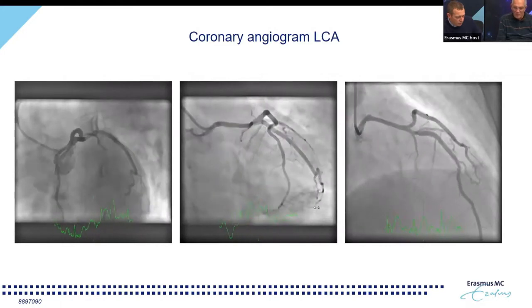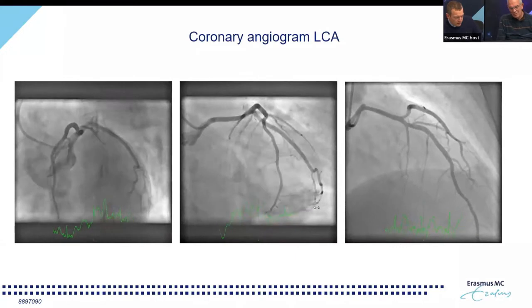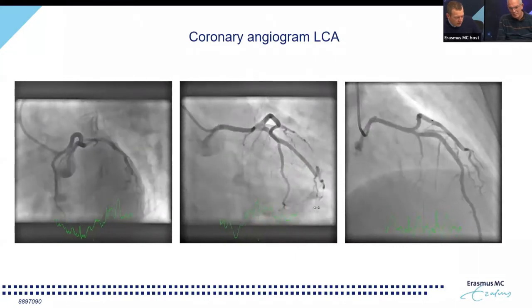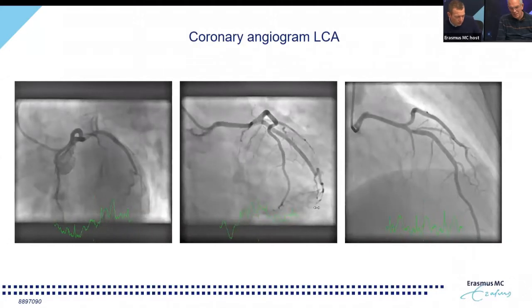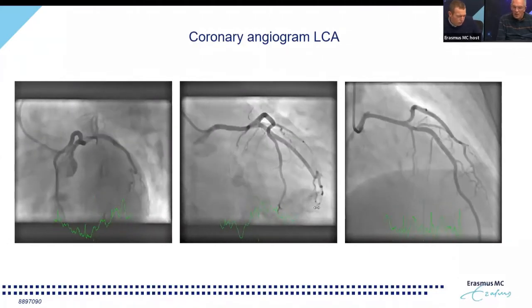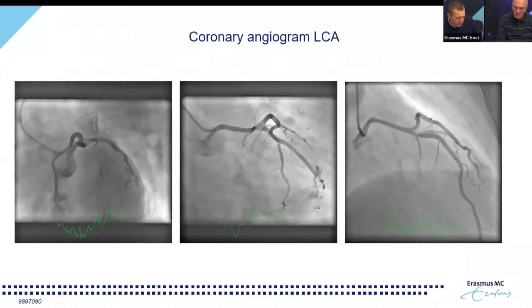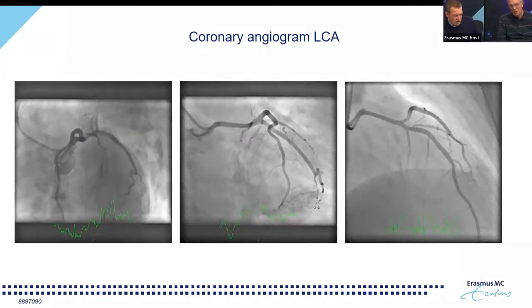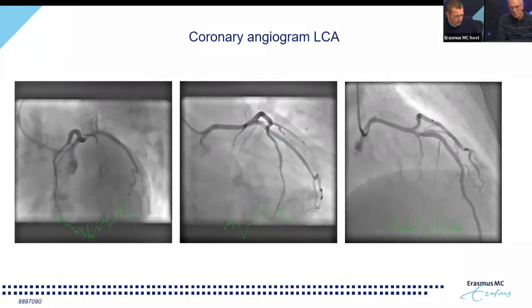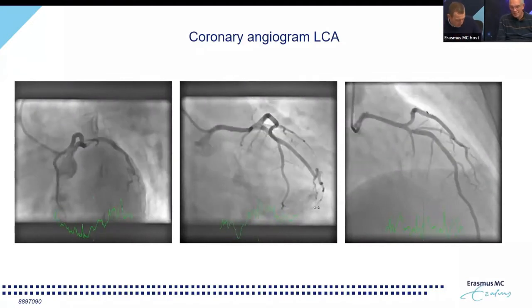The left main looked fine, and the LAD showed, after the takeoff of the very long left main and the circumflex, a very mild stenosis, which we could not really appreciate. But what you can also appreciate, and I think this is very apparent, is this diagnostic Judkins left 3.5 catheter, which is pointing very aggressively in the roof of this ostial LAD.